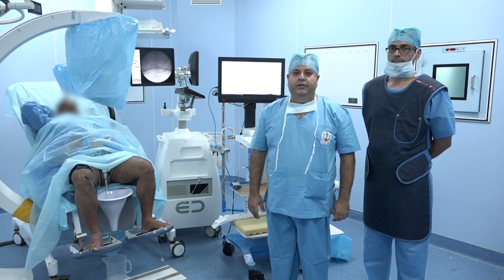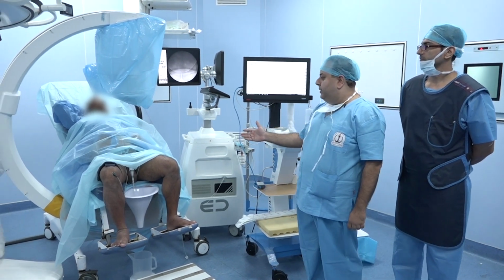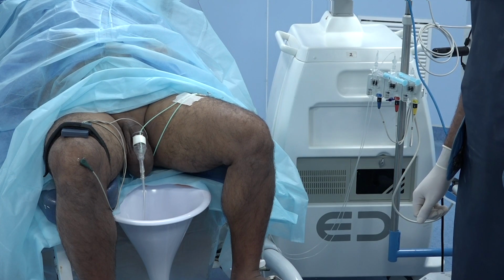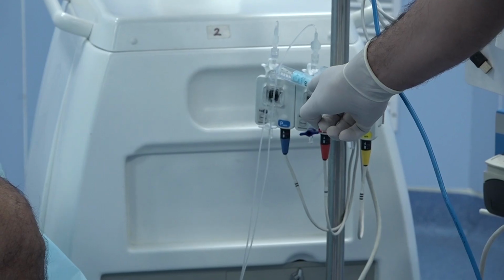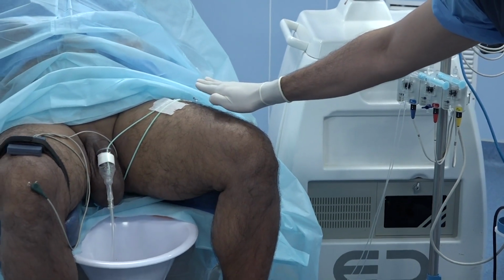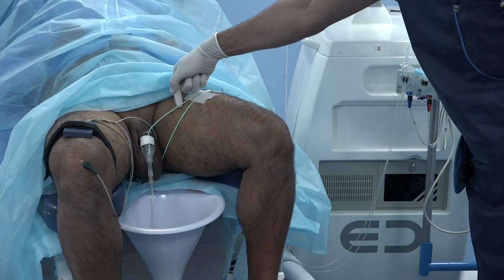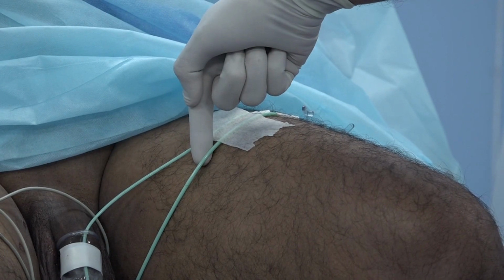Before we start, this is our urodynamic unit, this is our urodynamic machine, this is the urodynamic chair, and this is the C-arm. All procedures that are going to be demonstrated are as per the ICS standard good urodynamic practices. We are going to be using fluid-filled catheters with external pressure transducers. Pressure transducers will be at the level of the upper edge of the pubic symphysis and zeroing will be done to the atmospheric pressure. We shall be using a 6 French double lumen catheter to measure intravesical pressure and a 10 French rectal catheter to measure the abdominal pressure.